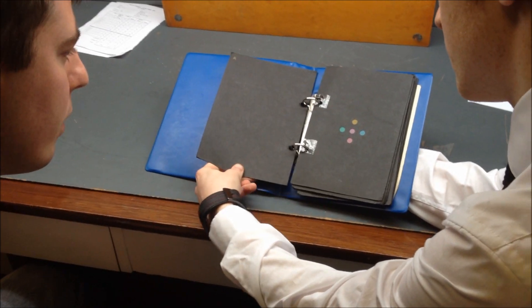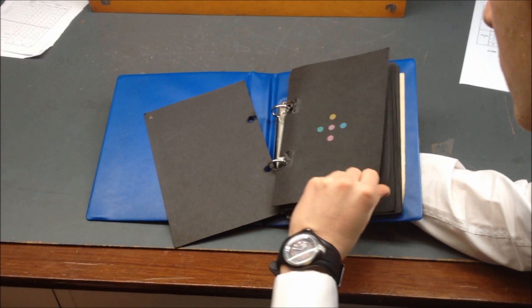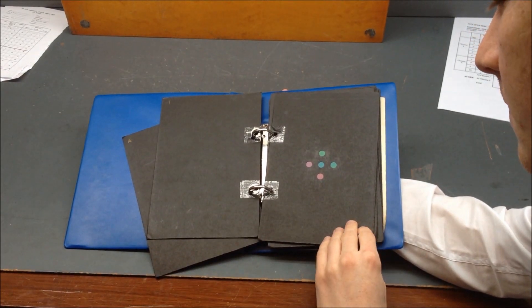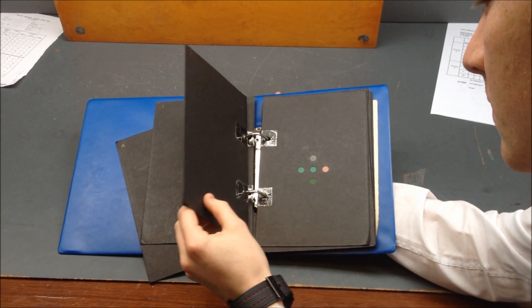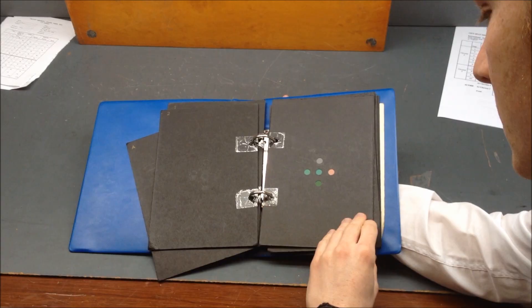What about this one here? Down. That's brilliant. Right. Left. That's great.